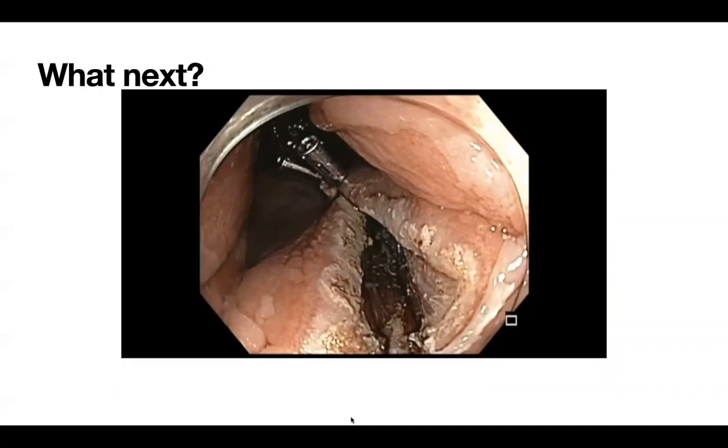So any comments, Roy, Sriram, Selvi? You did exactly what you did. It's like you're at 180 degrees from me today. Why? Because APC of the hemorrhoidal plexus is almost, I would say, beautiful, because it actually evaporates them.